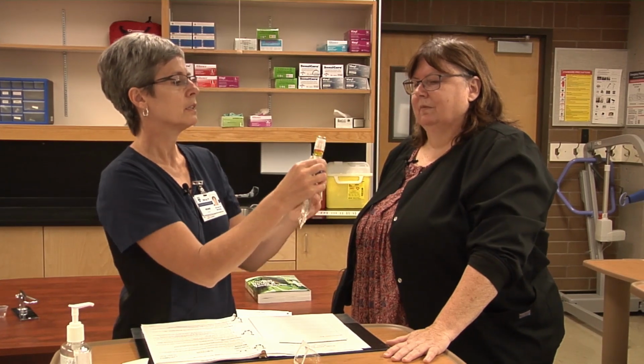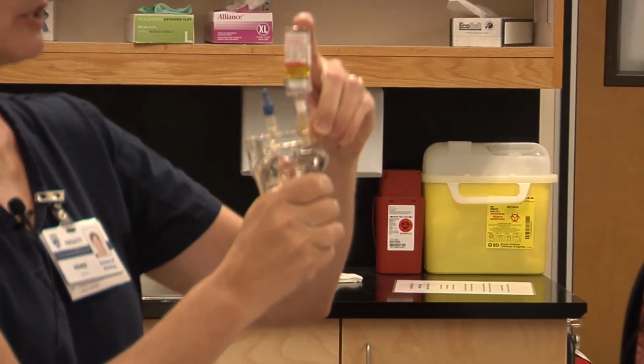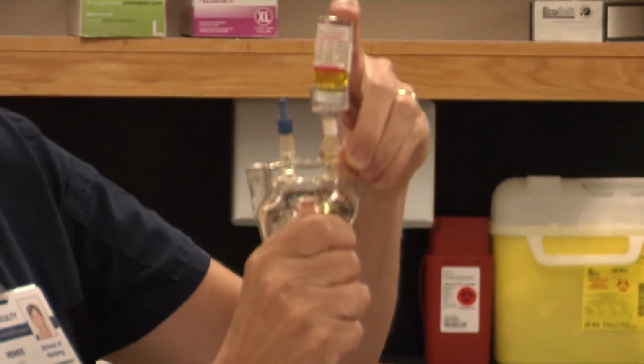So then you have a look, and if all of your powder is diluted, next we just need to transfer it into our mini bag. And simply you're squeezing it to displace this air up into the vial.